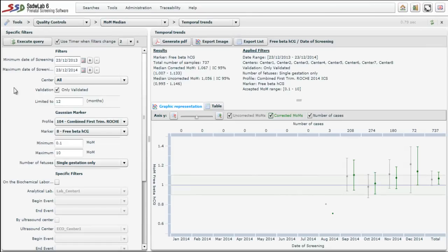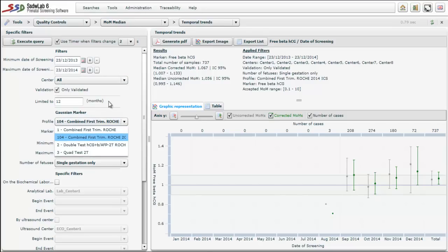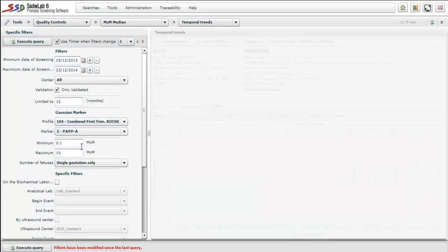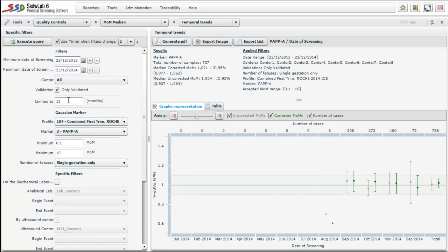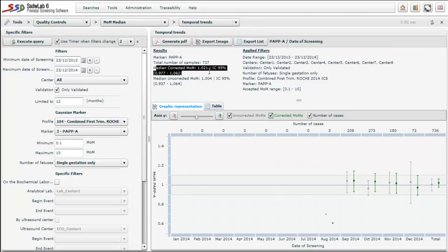On the left side of the screen there is a control panel. We can define the date interval, the profile we will analyze, and the marker — in this case pregnancy-associated plasma protein A (PAPP-A). We can also assess by number of fetuses. Once we have selected the controls, we execute the query. The screen presents the median of multiples of the median corresponding to PAPP-A. The median corrected MoM is 1.021 and the median uncorrected MoM is 1.004.